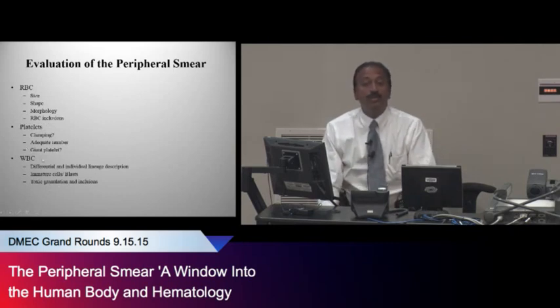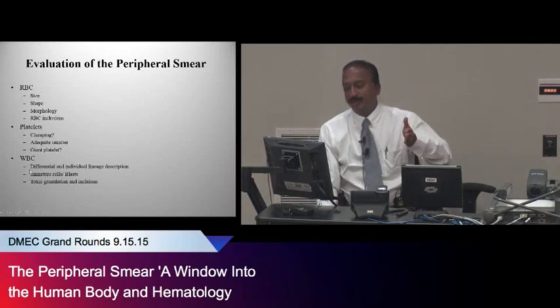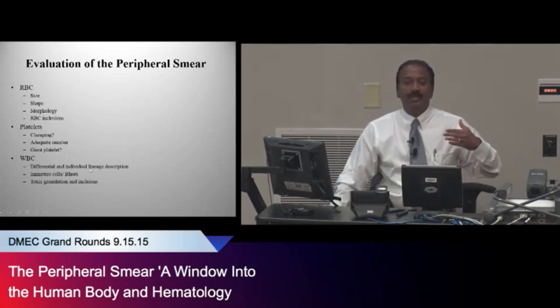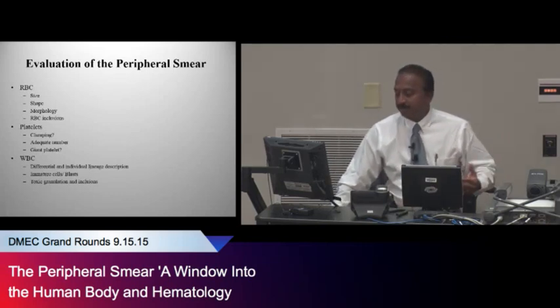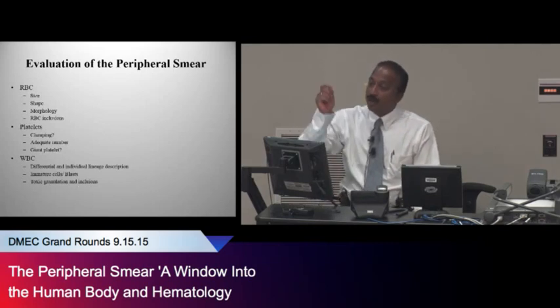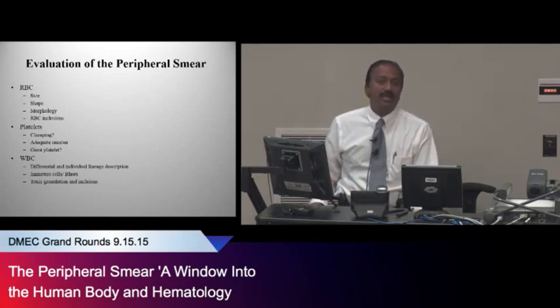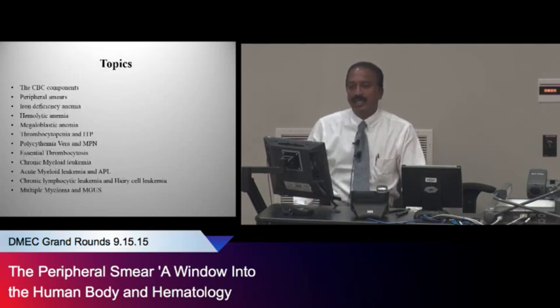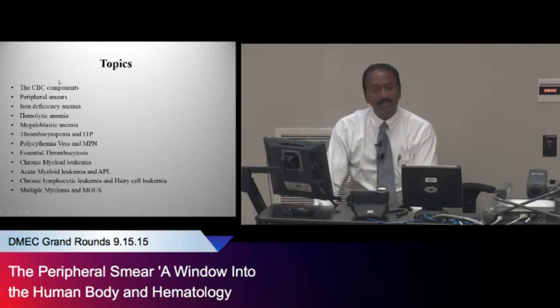Then you come to the blue, which is all your leukocytes. And you go look at the differential, look at individual lineages, look at your neutrophils separately, look at your lymphocytes separately, look for the immature cells and blasts. Then you look for the inclusions, you look for the toxic granulation. Then you record it in the same way. Now, you guys as internists are not expected to do all this. My fellows ought to be recording all this in a certain fashion, just like you would record an EKG or an echocardiogram.